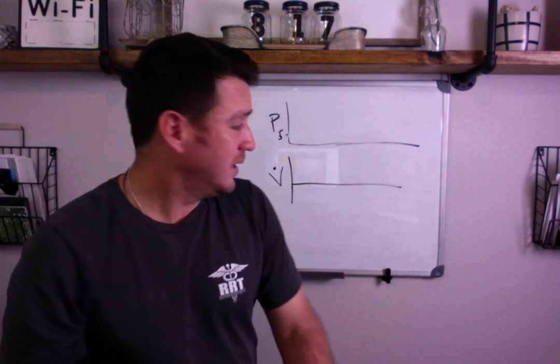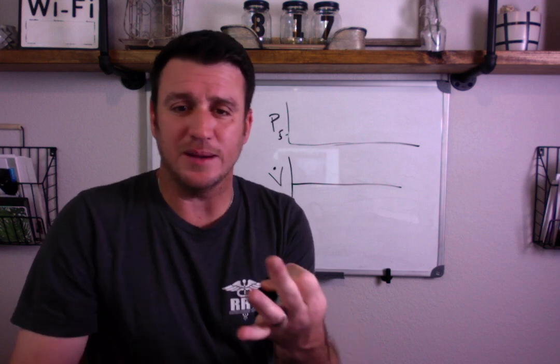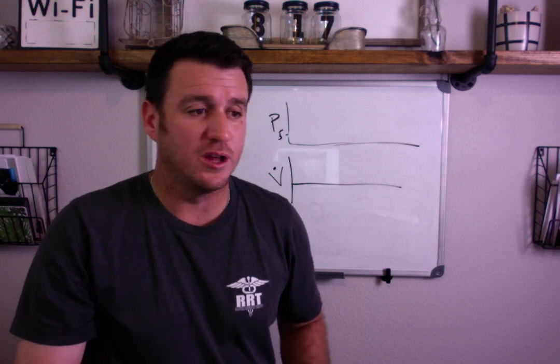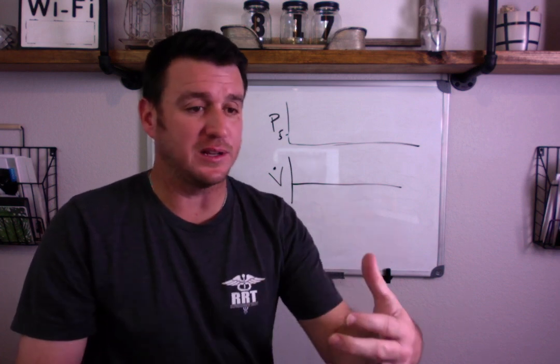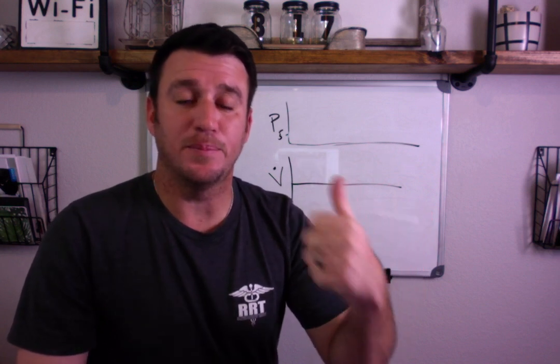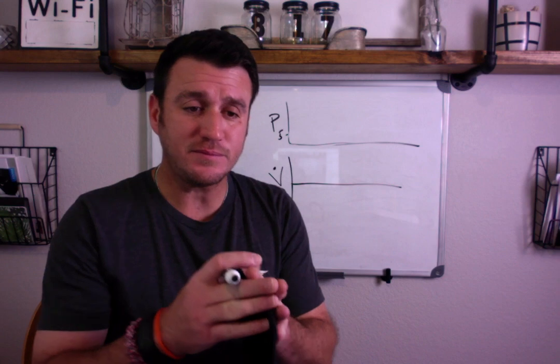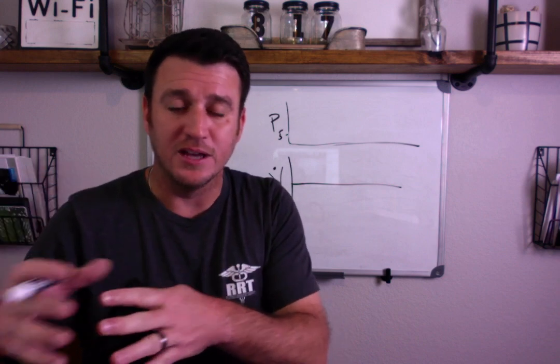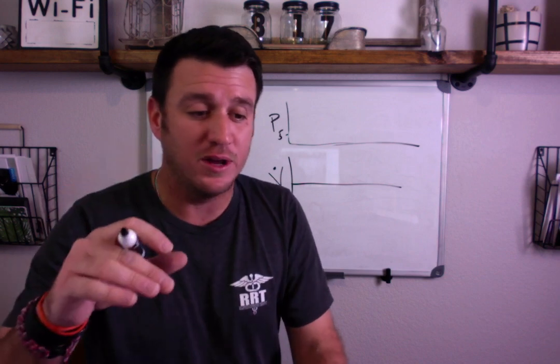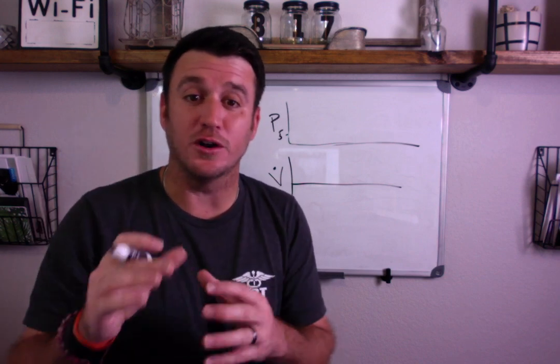Okay. Now the next two examples I'm going to give you, and I'm only going to give you 3 examples because clinically what I've found is that those 3 examples are typically the most common. The first one being failure to trigger a patient-triggered breath. The second one is early breath.